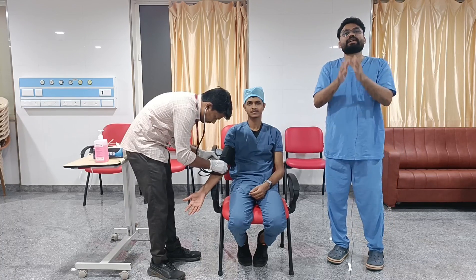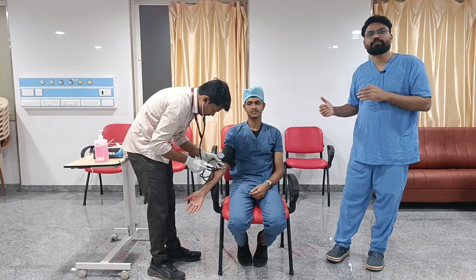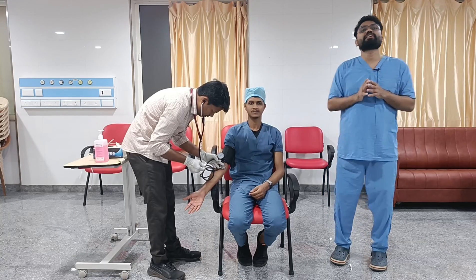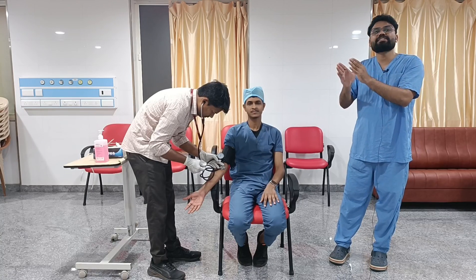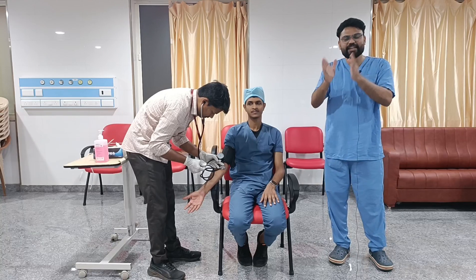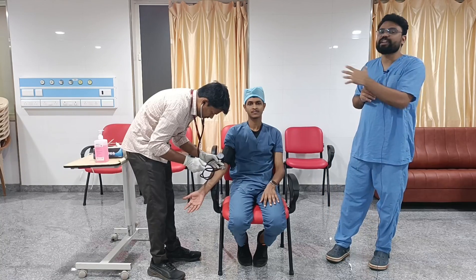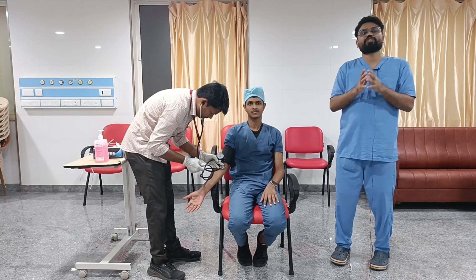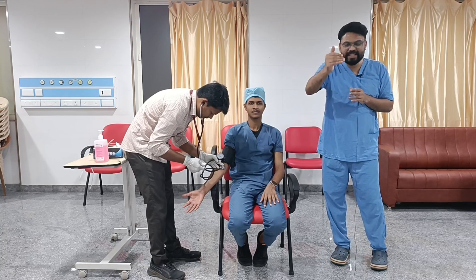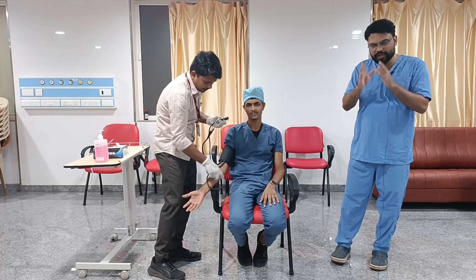We increase the blood pressure 20 to 30 mmHg above the palpatory systolic reading, then use the auscultatory method, gradually decreasing at 2 mmHg per second. Appearance of the Korotkoff sound marks systolic blood pressure and disappearance marks diastolic. Ideally, we take 2 or more recordings on 2 or more separate occasions, and these should be documented to calculate the average.